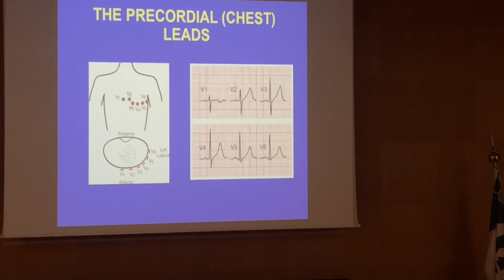So, what do you expect the P wave to be? Positive, negative, or biphasic? And why? Could be negative, or positive, or actually biphasic. The commonest is this morphology you see. There is a small positive followed by small negative. Why small positive? Right atrial activation.